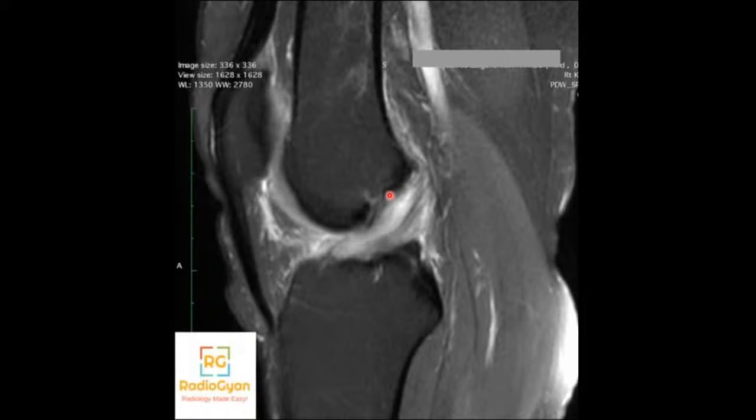So what is this appearance, and what is the sign, and what is the diagnosis? Okay, perfect. So everybody rightly pointed out. So this is a celery stalk appearance of mucoid ACL degeneration. So this is a sagittal water sensitive sequence. What we see here is that the ACL is thickened and hyperintense. So that resembles a celery.